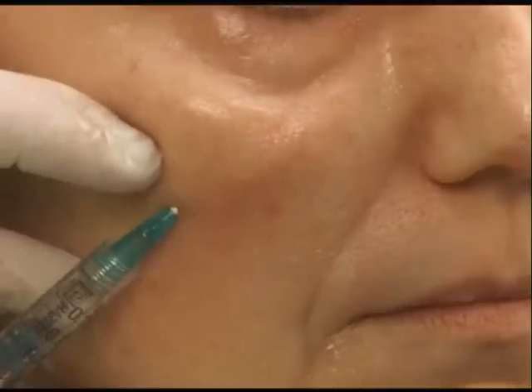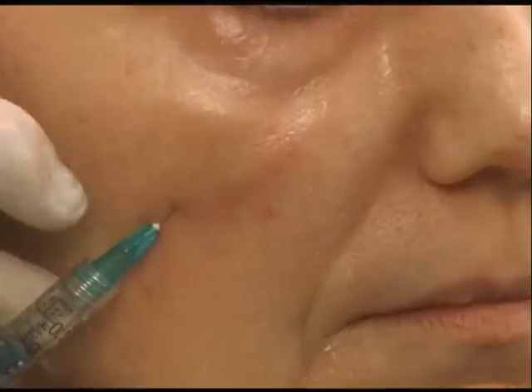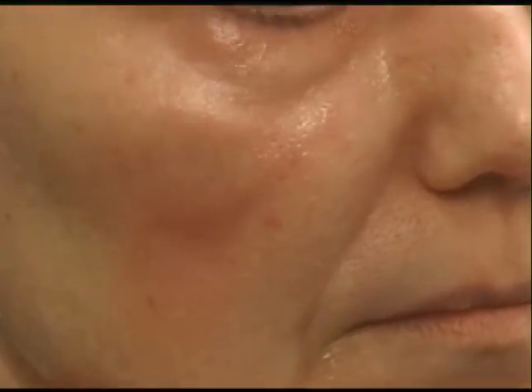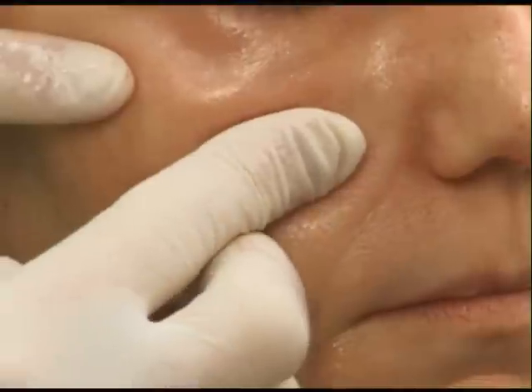Sometimes if you're too close in the dermis, too close to the surface, it almost makes the area you just injected look flat. And we're going to just mold it a little bit.